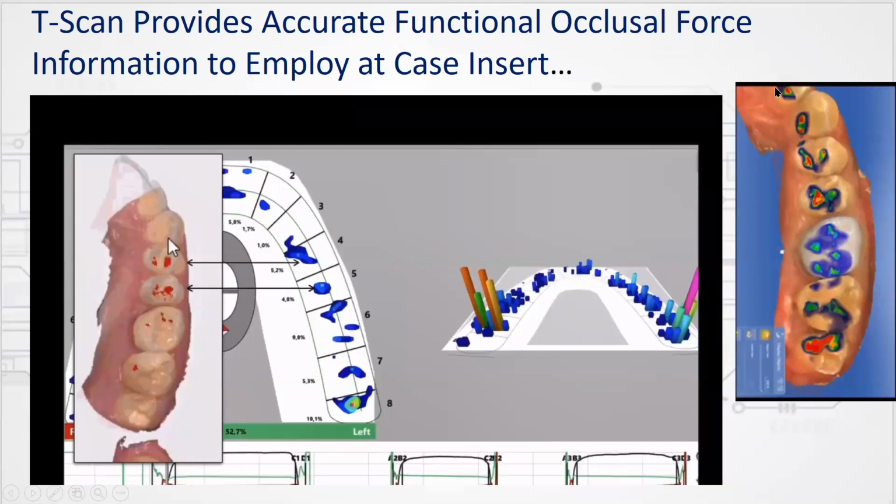So this is interesting. There's a lot of red annotation here. Red in this scanning program, excuse me, means solid contact. So there's solid contact, but solid contact doesn't mean high force. It means there's good occlusal interdigitation. The only place there's high force is on the 8, and it isn't this area. It's actually a very small area, right? That's where the high force is, in the middle of the solid contact.